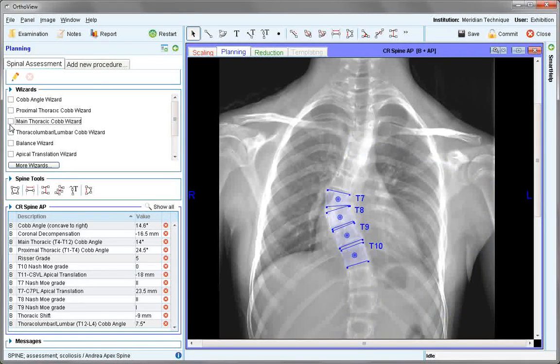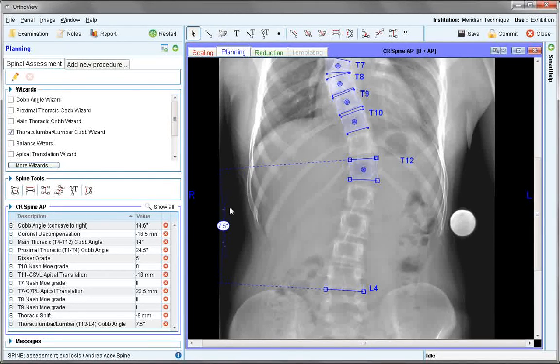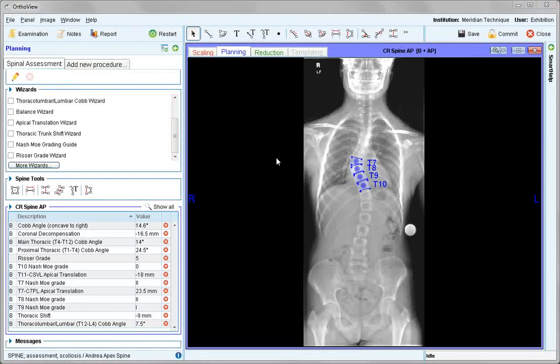In the third step, the thoracolumbar Cobb. All of the wizards here have been collated from the spinal deformity study group and some other resources. All angles are recorded in the results panel.